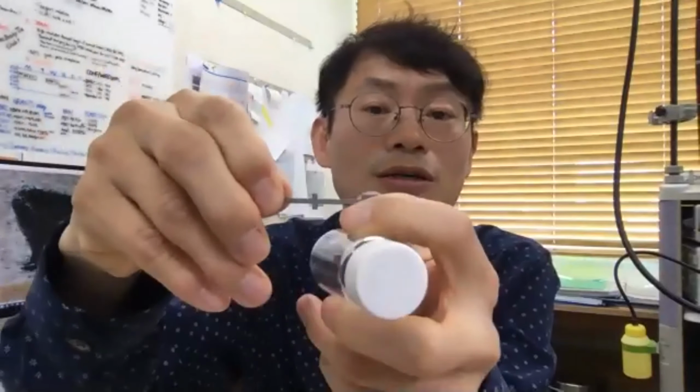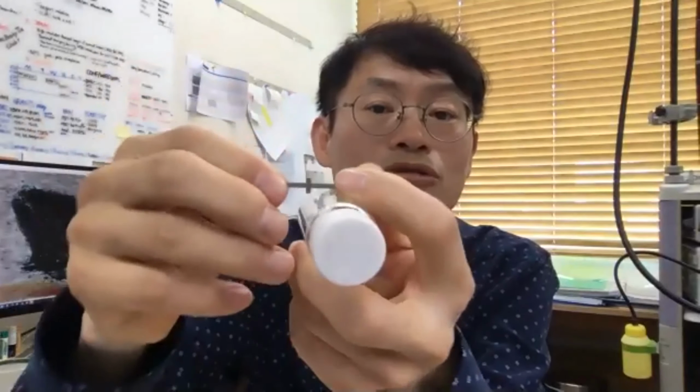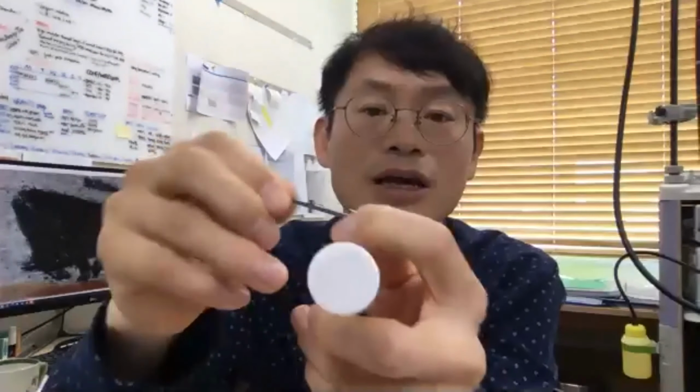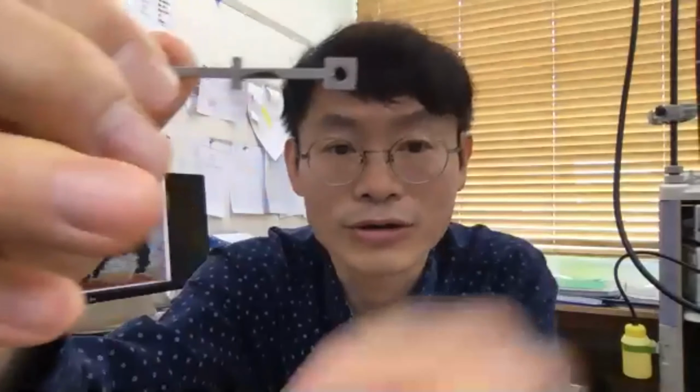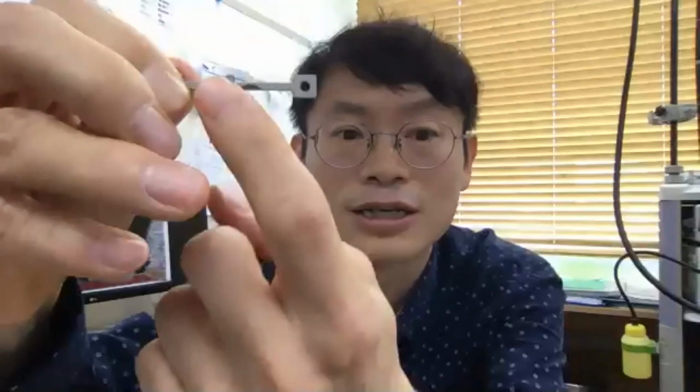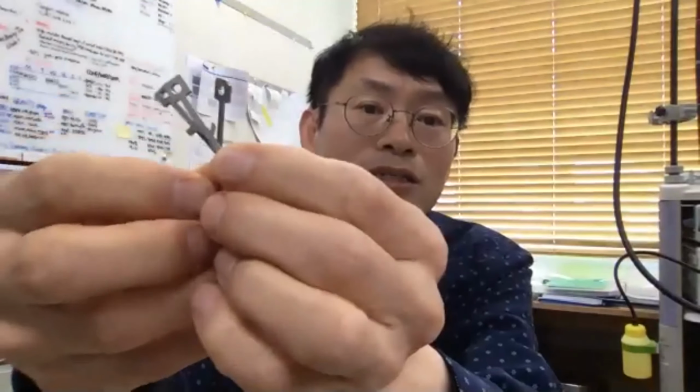You see the little hinge here. When you attach it onto the skull, make sure it is clean. And you can see I ground this part, because the shape of the mouse skull is curved. This way you can attach it more closely so that you can grab it better. All these head bars are made out of titanium, so that they are lightweight but strong enough.